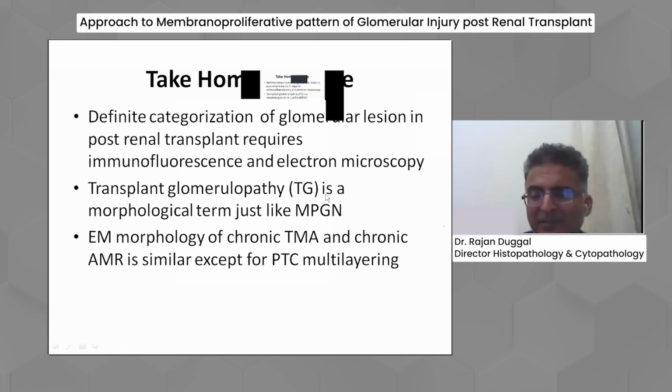But I'm telling you, this is not 100%. It is just that after seeing so many biopsies, we keep on correlating with the trough levels. So based on histology, if I see a segmental glomerular TMA or segmental vascular involvement in TMA, I would say that this is possibly CNI-induced TMA. If you ask me about chronic TMA due to CNI, I don't commonly see it. Chronic TMA we mostly see due to either chronic hypertension or chronic AMR. You can see it in chronic CNI toxicity, but in a transplant setting chronic TMA is mostly due to chronic AMR.